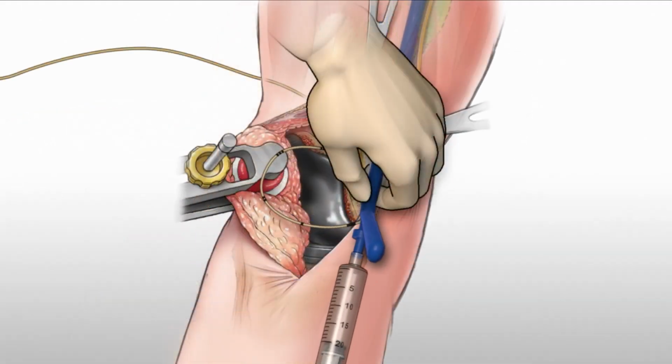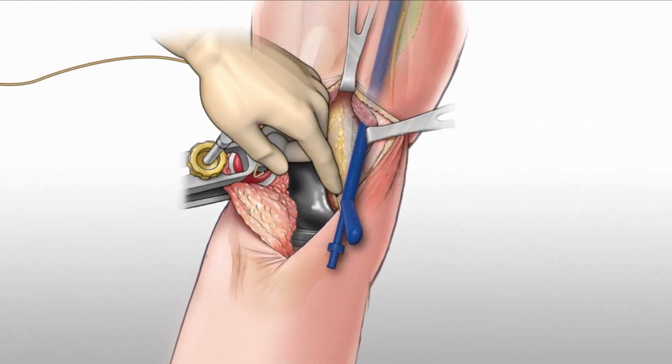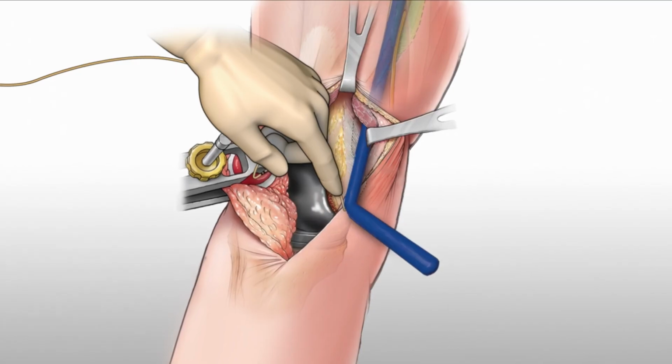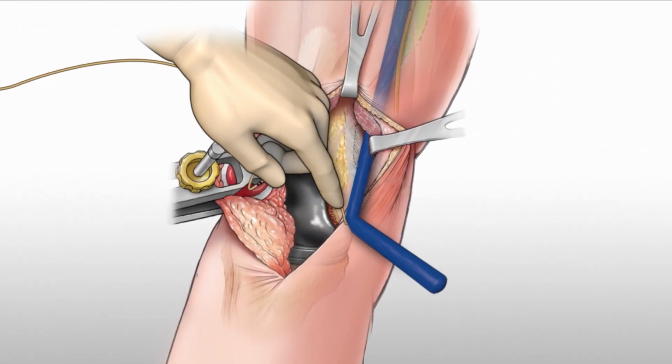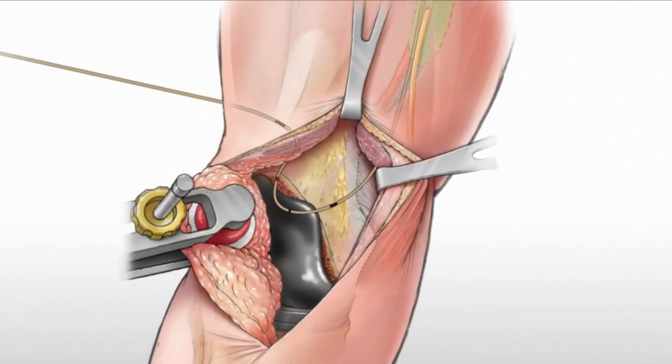Attaching a syringe to the introducer, the surgeon can bolus a dose of local anesthetic to provide an adductor canal block. Pinching the catheter against the femur, the trocar is removed. Rotating the handle medial while continuing to pinch the catheter against the femur, the slotted cannula is removed. The small loop of catheter is reduced by gently pulling the catheter snugly against the femur, leaving the catheter in place to provide a continuous adductor canal block.